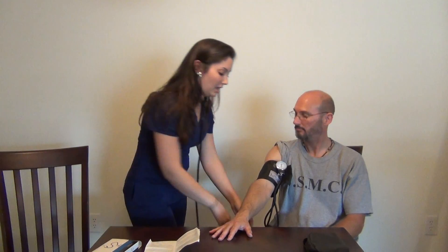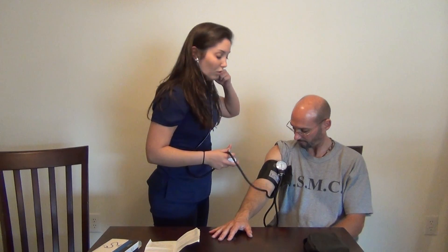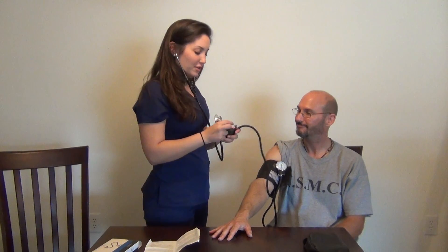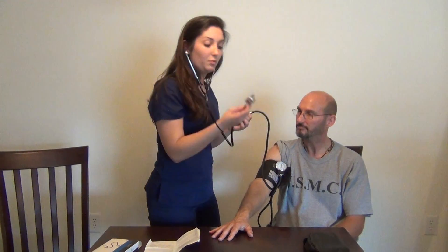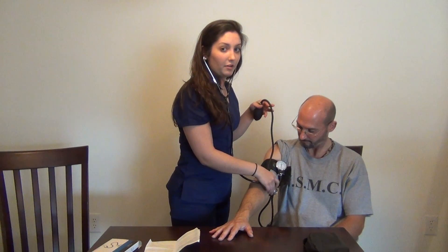Put the stethoscope earpieces in and get ready. When you start to inflate the cuff, you only want to inflate it to about 180 to 200. That should be plenty of air, unless your patient has high blood pressure — then you might have to go a little higher. Make sure the valve is locked on tight so that the air doesn't come out; that's just righty-tighty, lefty-loosey, so make sure it's all the way to the right. Inflate it to 180, and place the diaphragm of the stethoscope — the larger part — on that brachial artery you found earlier.